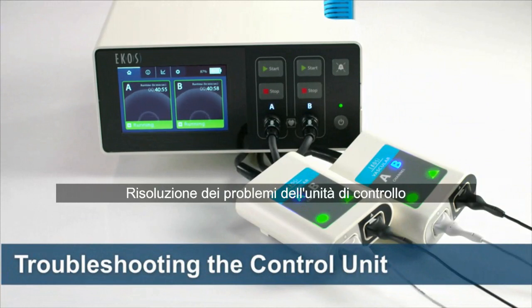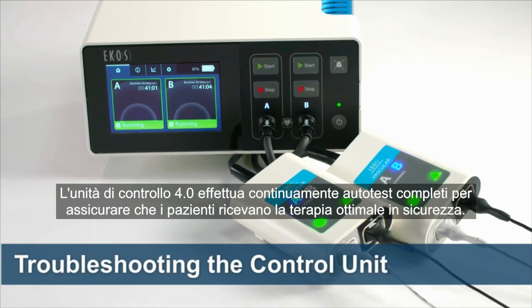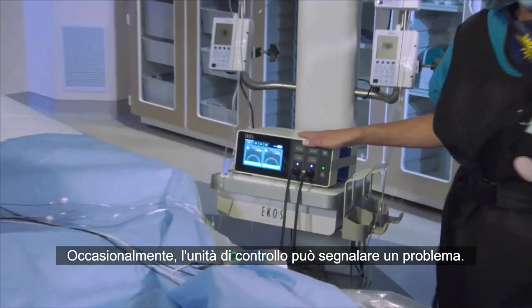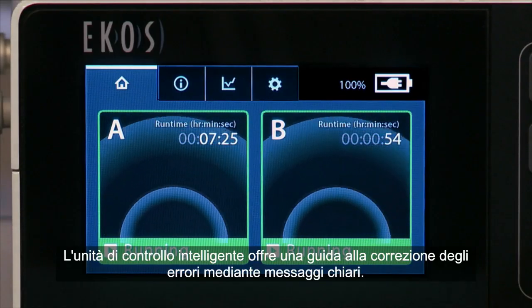Troubleshooting the control unit. The Control Unit 4.0 continuously performs extensive self-tests to ensure that your patients safely receive optimal therapy. Occasionally, the control unit will alert you to a problem. The control unit will use its extensive intelligence and clear messages to guide you in fixing errors.